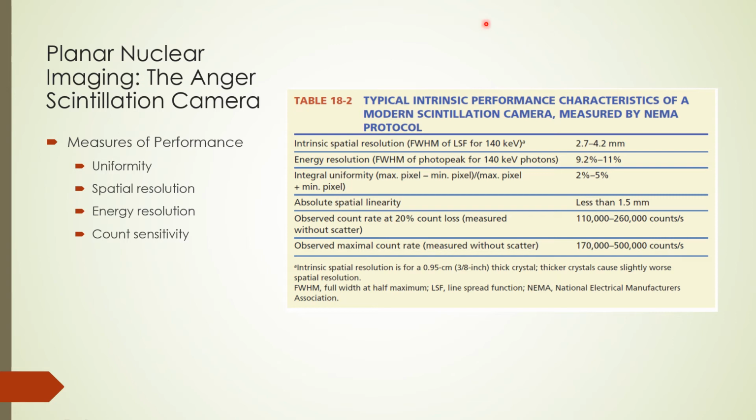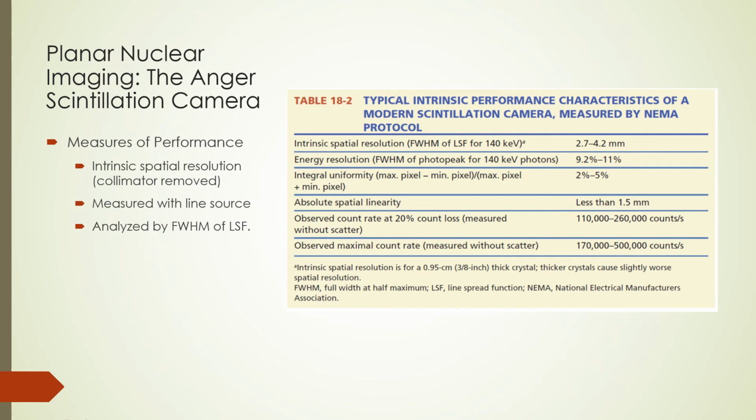The uniformity can be evaluated using software and compared to manufacturer's stated uniformity. The data should be recorded and compared to other uniformity measurements done over time. Spatial resolution is the ability of the camera to distinguish objects with different activities.